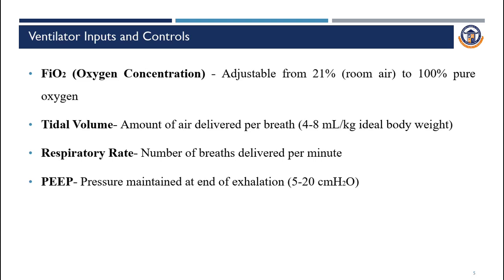Ventilator inputs and their controls are FiO2, which provides the oxygen concentration, adjustable from 21% to 100% pure oxygen, and then respiratory rate, which defines the number of breaths delivered per unit time, and then PEEP, which is the pressure maintained at the end of exhalation.